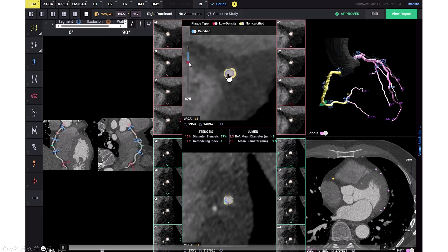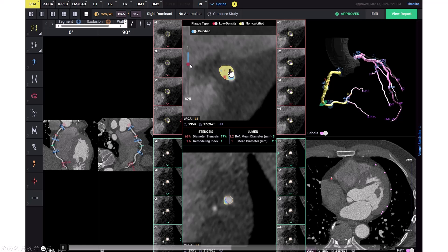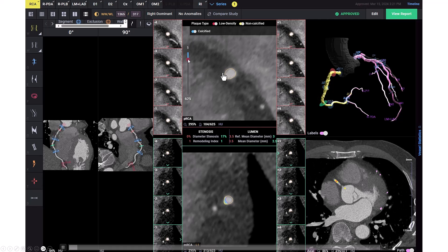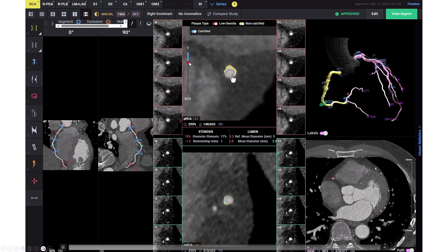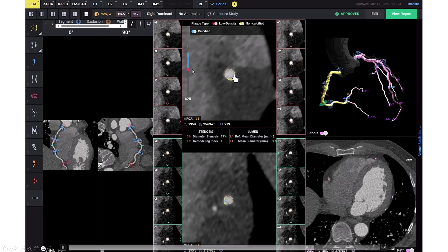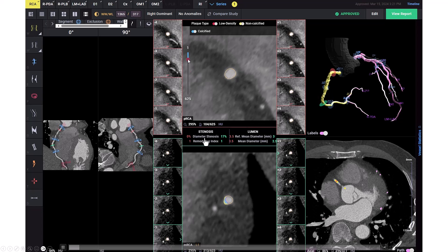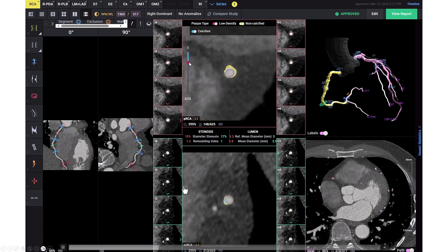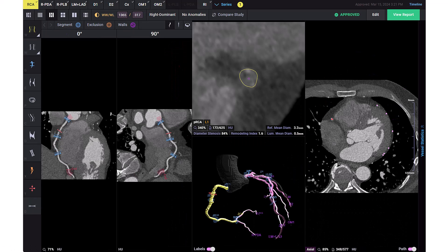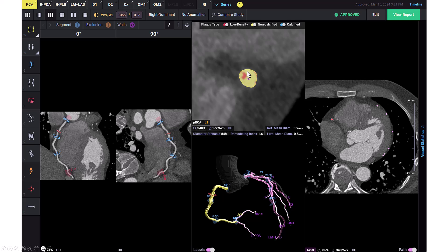What we can see here is the plaque composition as we scroll through the occlusion. Yellow is lipid and blue is calcium. What we're seeing is that it's mainly yellow — mainly lipidic — but there are some calcified spots inside the artery. So this seems to be a soft plaque rather than a calcified plaque. This is the area of the minimum lumen area, showing a fatty plaque at this particular spot.